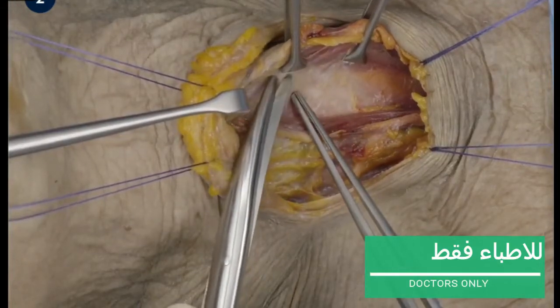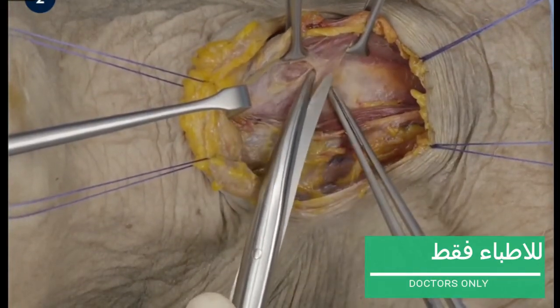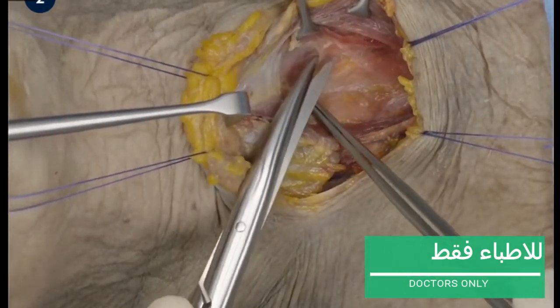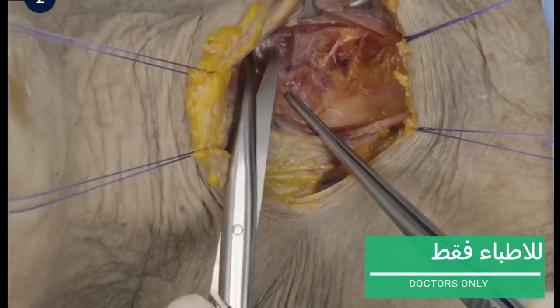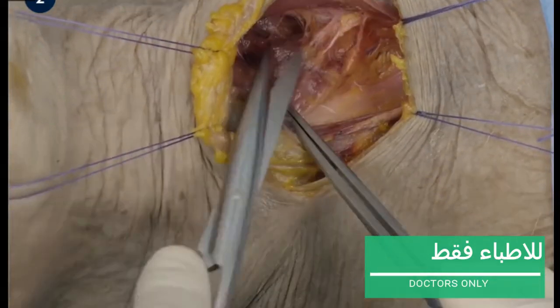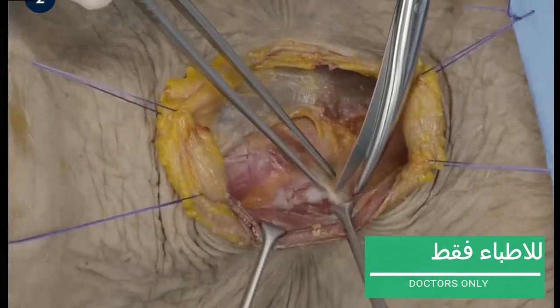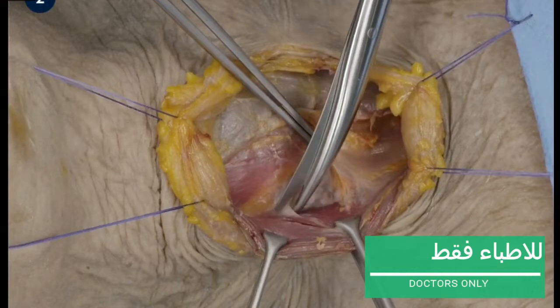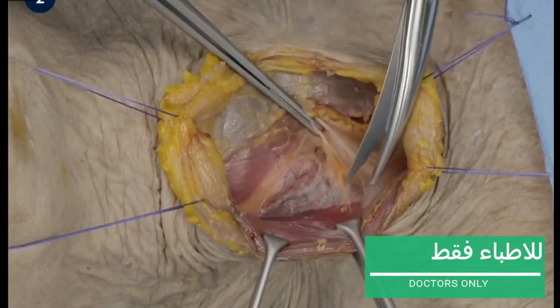The edges of the sternohyoid are lifted together with the sternothyroid muscle, and both muscles are dissected off the thyroid gland. Here the carotid artery is reached. Dissection is continued on the capsule of the thyroid gland until the middle thyroid vein is identified.